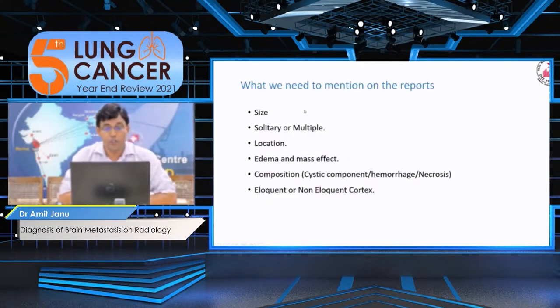The thing that we need to mention in the reports is the size of the lesion. So if it is significantly large, up to what limit they can give the SBRT, up to what size they can remove surgically, whether the lesion is solitary or multiple, that also has to be highlighted, because these are the constraints for surgery, for SBRT, and whether we have to give WBRT.